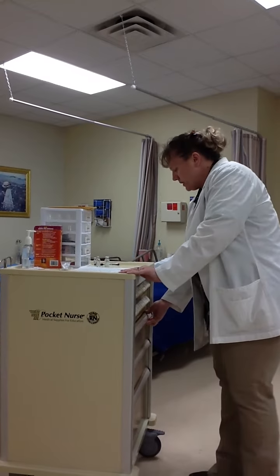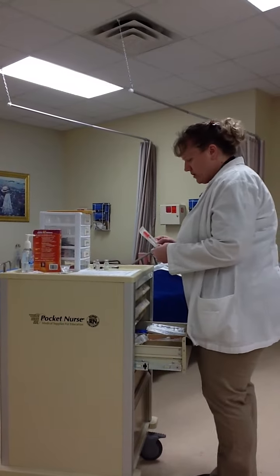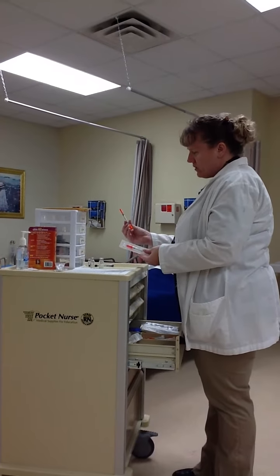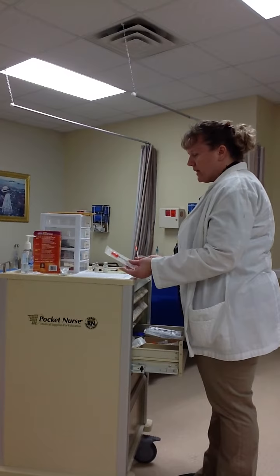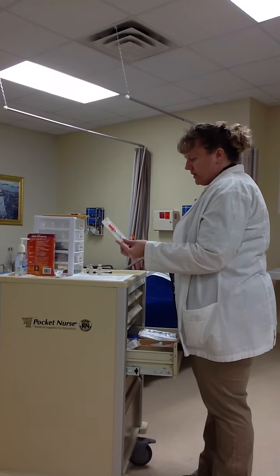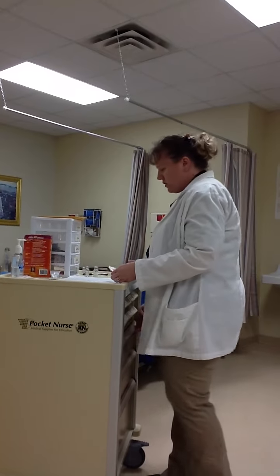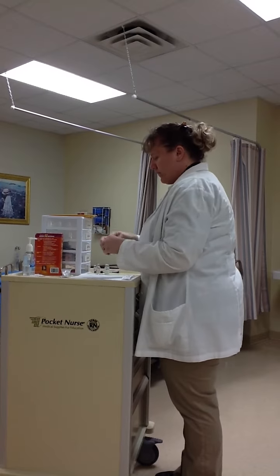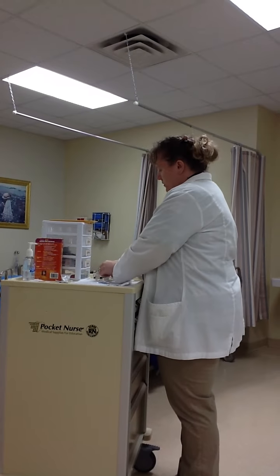I note that I will need an insulin syringe. There are many different types in here. You have a 50 unit syringe, and you may have a 100 unit syringe. Decide based on your dosage. I have a 28 total. It's going to be easier for me to use the smaller 50 unit syringe than the 100 unit. So I've chosen a 50 unit syringe. I'm going to get both of my vials ready. Since both of them were opened, I will use alcohol to clean them off.